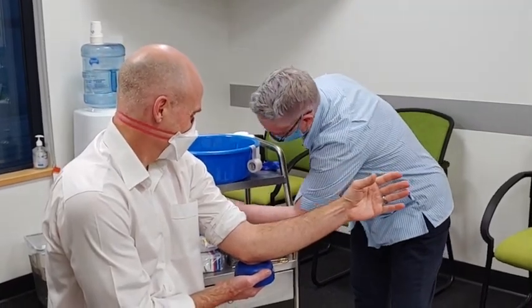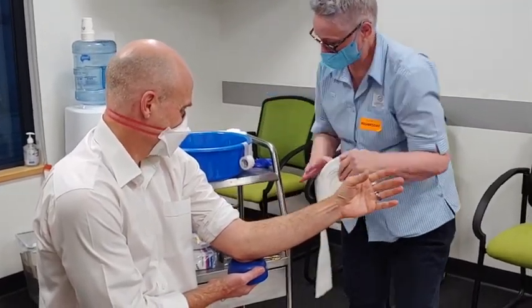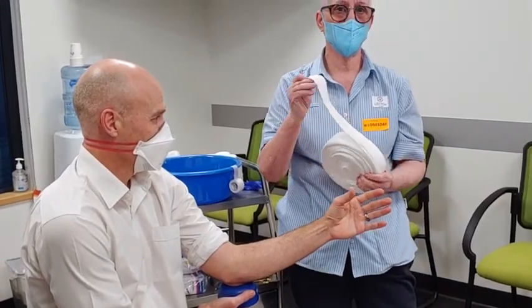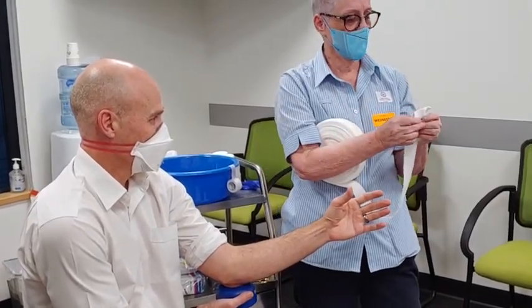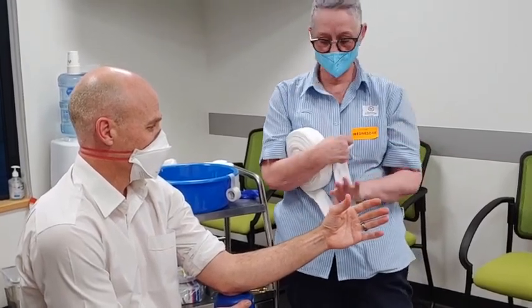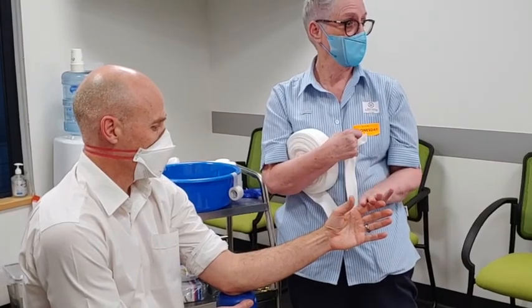We take our stocking net. The product we use is ProTouch — it's a cotton one, but it doesn't matter what brand you use. When you're measuring this, it actually shrinks down because you're stretching it over the limb. The size two goes really nicely over an arm.